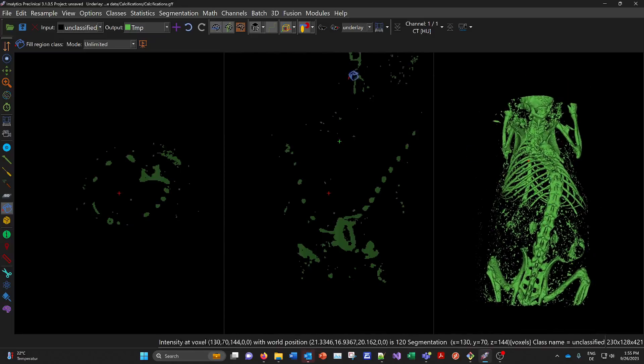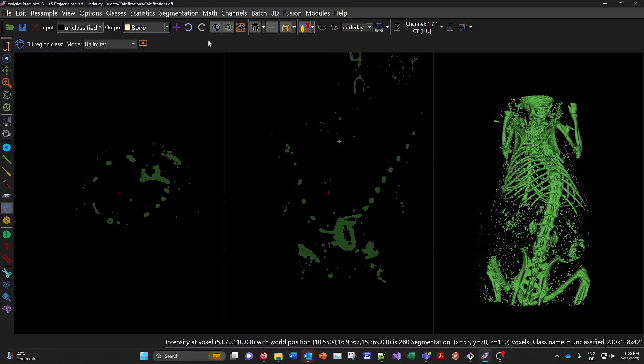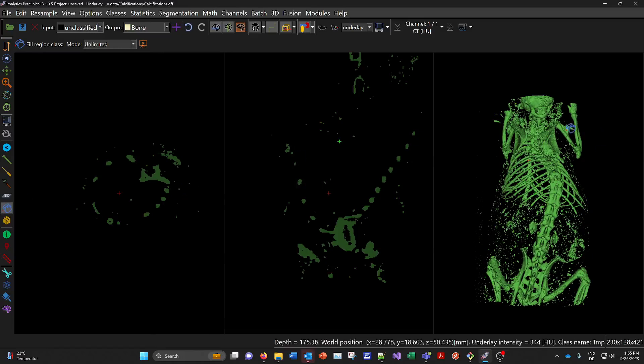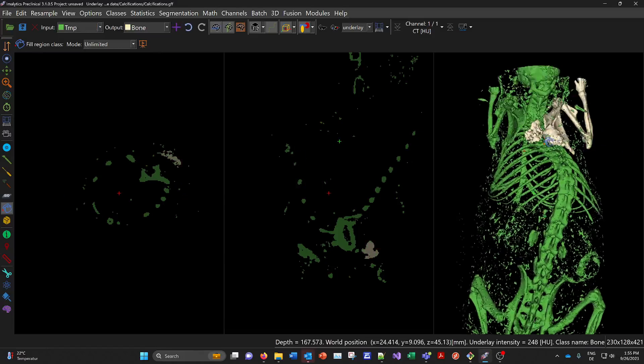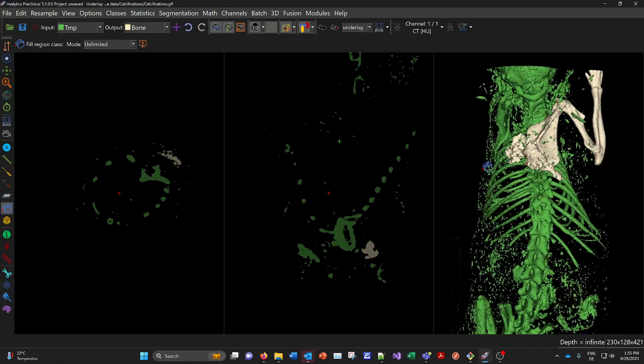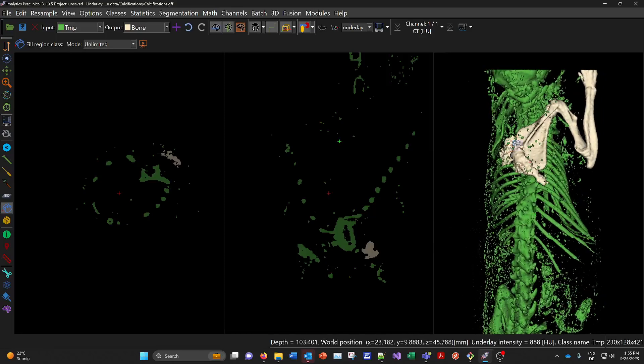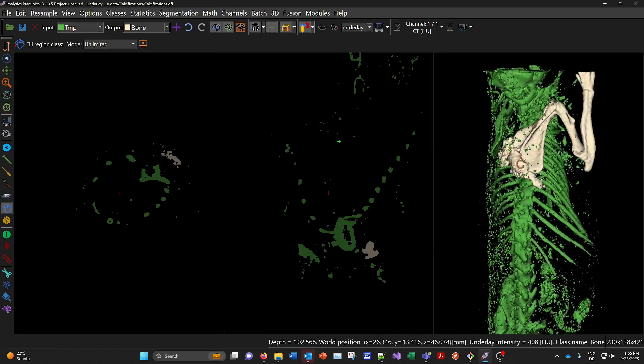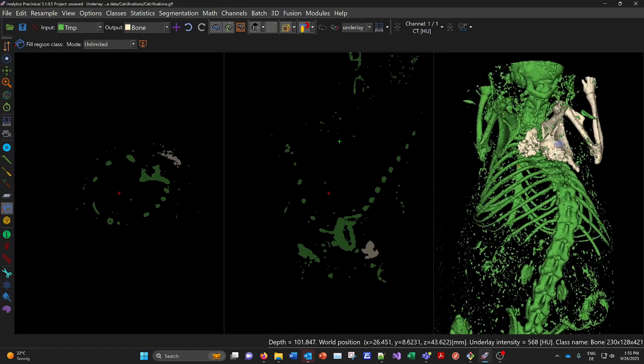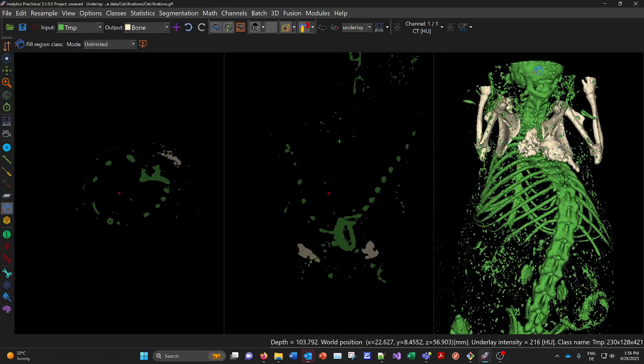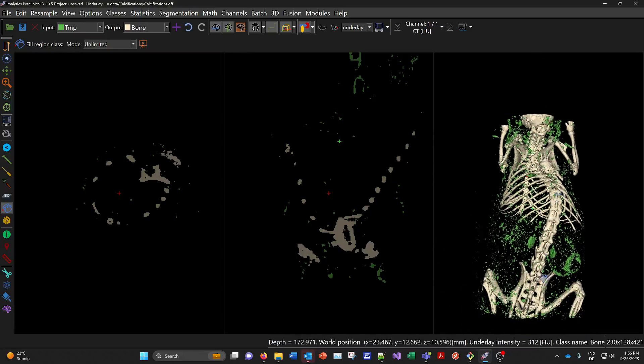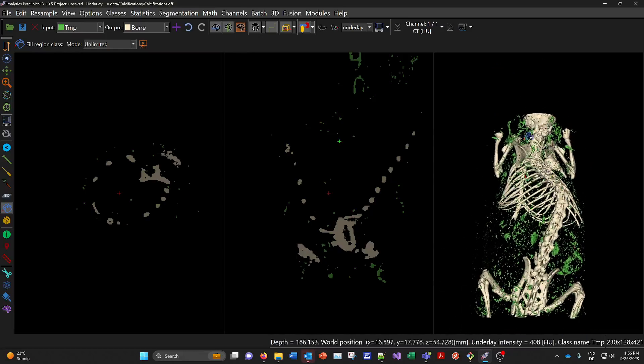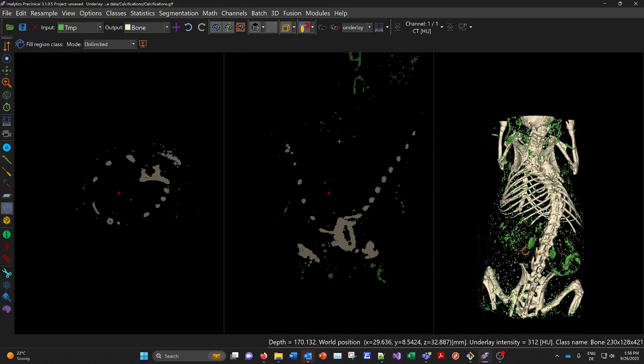And let's add a bone class. And try to fetch here the bones, the arms. There you see already here we have some part here. These calcifications are connected to the scapulae here. So they are caught. If you pick this one, this is not connected. And the spine also is, the skeleton is also nice to grab.